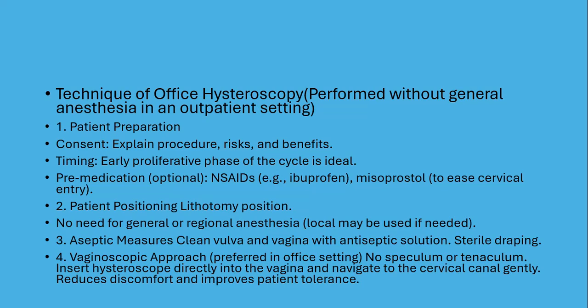3. Aseptic measures, clean vulva and vagina with antiseptic solution. Sterile draping. 4. Vaginoscopic approach, preferred in office setting. No speculum or tenaculum. Insert hysteroscope directly into the vagina and navigate to the cervical canal gently. Reduces discomfort and improves patient tolerance.